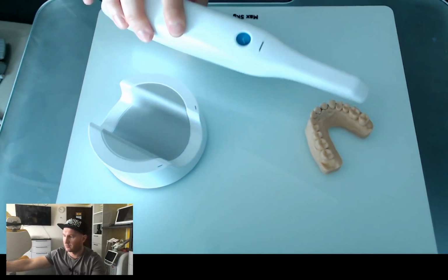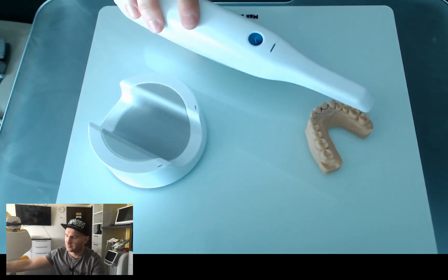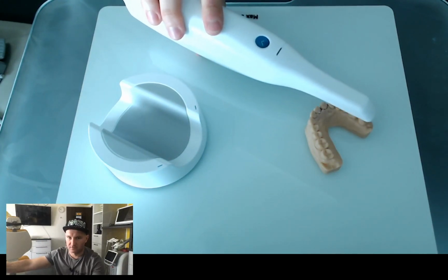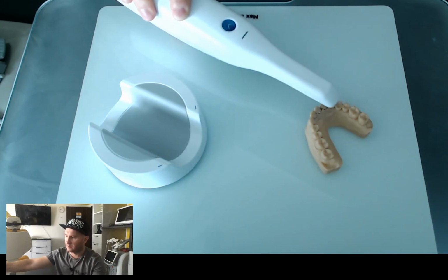But when you perform an intraoral scan, when you start scanning, your scanner sees, let's say, only this area here. Next time it sees this area here, and so on and so on.